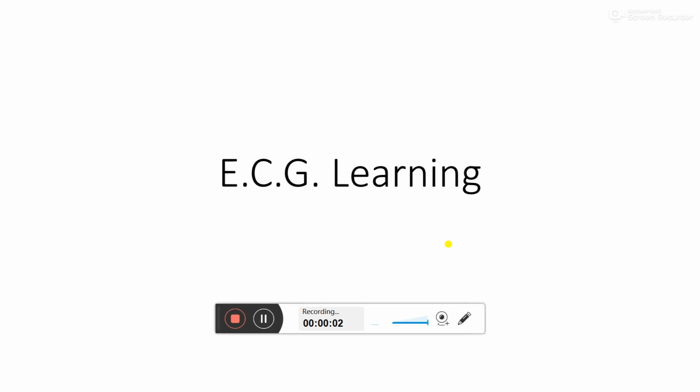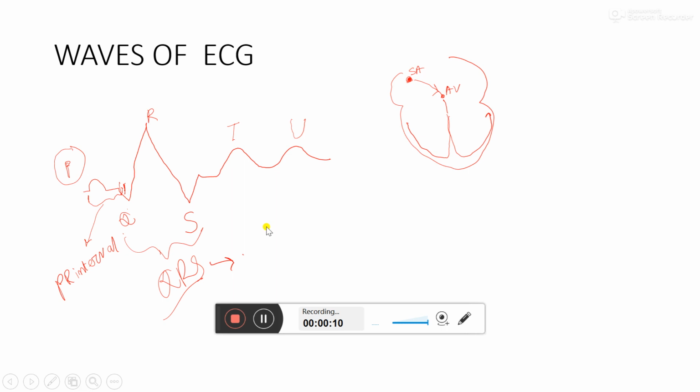Hello, now I am going to discuss some basic things of ECG. ECG is the graphical representation of the electrical activity of the heart. If we draw a diagram of the ECG, it has some waves.